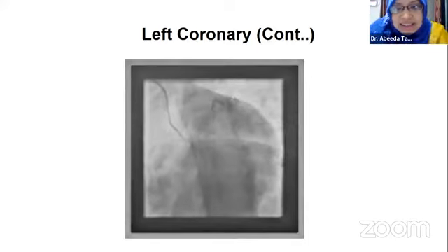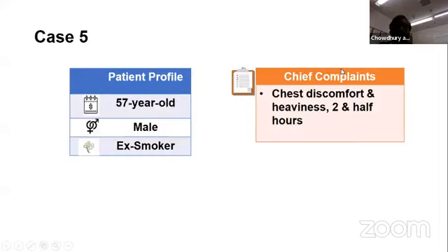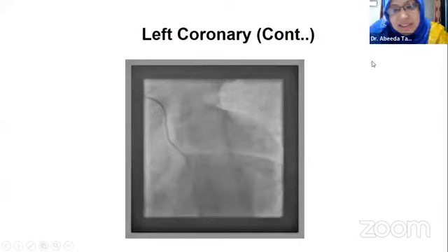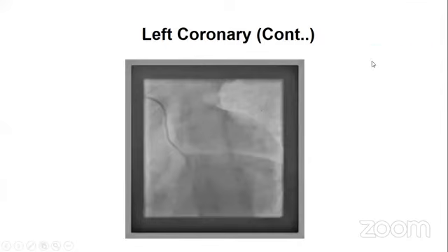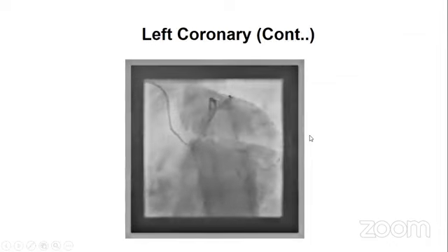Sir, did you do any ventriculogram? No, sir, we did not do the ventriculogram. That would have shown whether there was any aneurysmal dilatation or not, the akinetic segment. Okay, yes, sir. And sir, regarding the coronary status, that's a recanalized LAD.